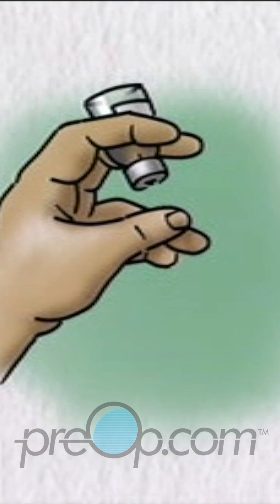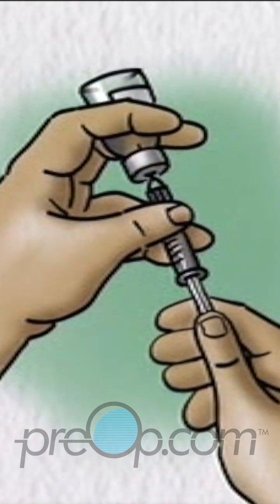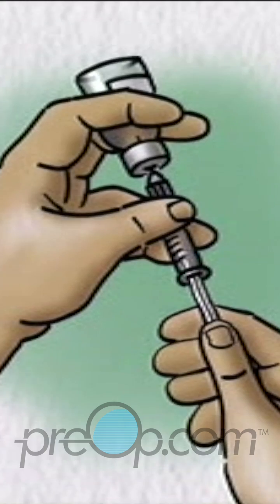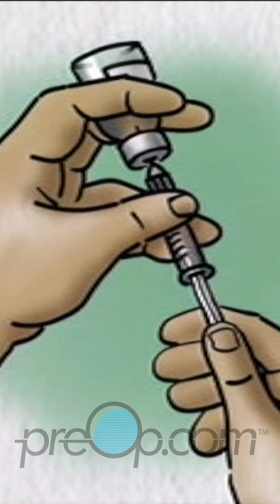Go back to the longer acting cloudy insulin bottle. Turn it upside down, insert the needle into the liquid, and slowly pull back the plunger to measure your total dose — in this example, 25 units. You are now ready to give your injection.